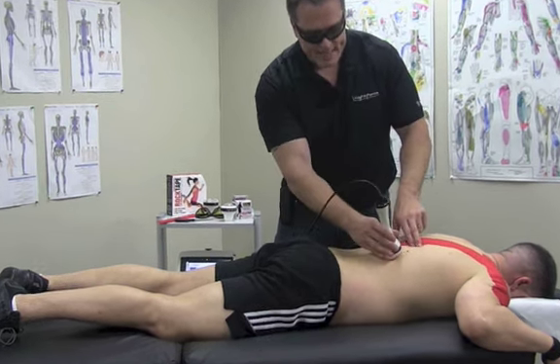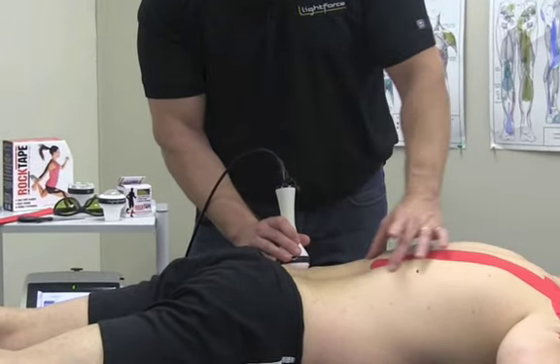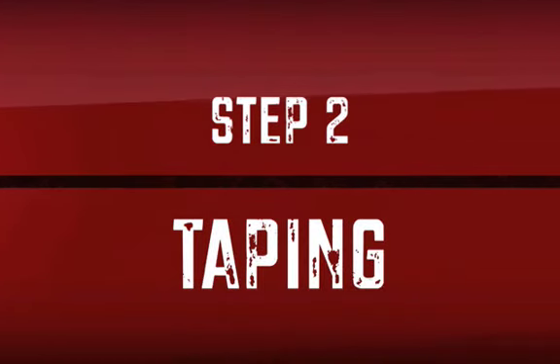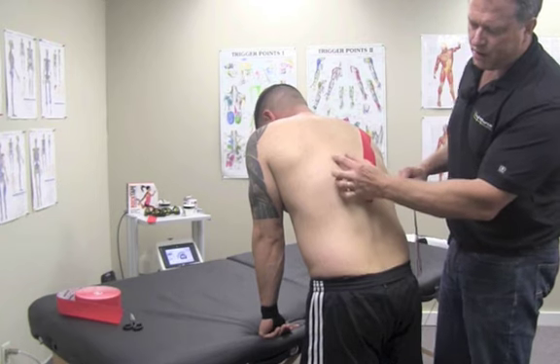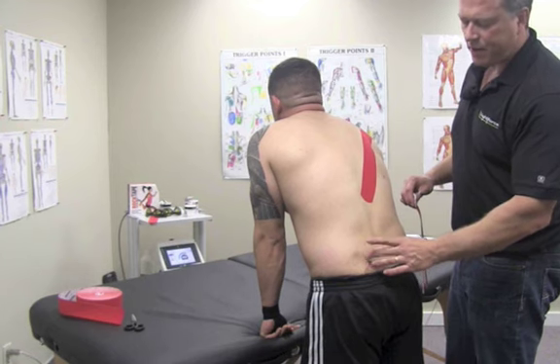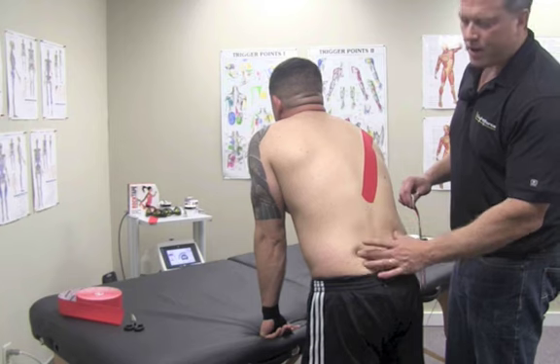Then once we relax this with the laser, we're going to go in and put a strip of tape up each side and then a support strip across the bottom. So when we do taping in the lower back, we're going to put one strip up the paraspinals here and one up the other side, and then a support structure right around where most people feel the biggest amount of stress, which is typically L5, S1, but you can do one here and one there if you like.